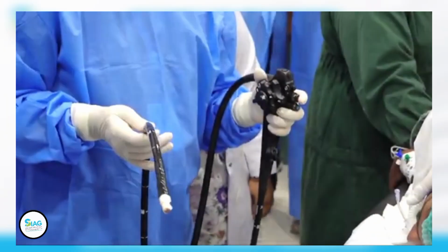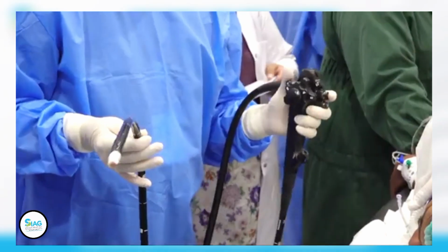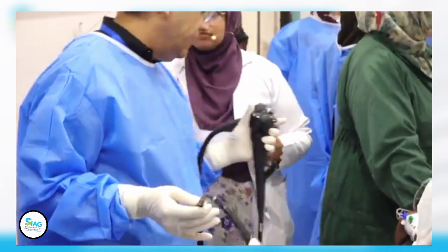And another thing is that we were planning to do a patient with relatively normal anatomy, but there were some other issues, so we have to switch the patient. But we'll go ahead and present the case.